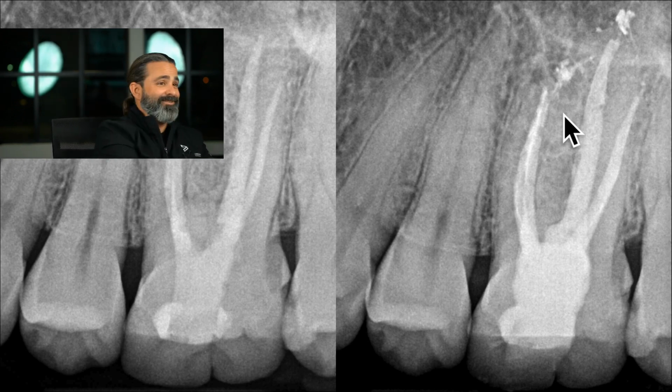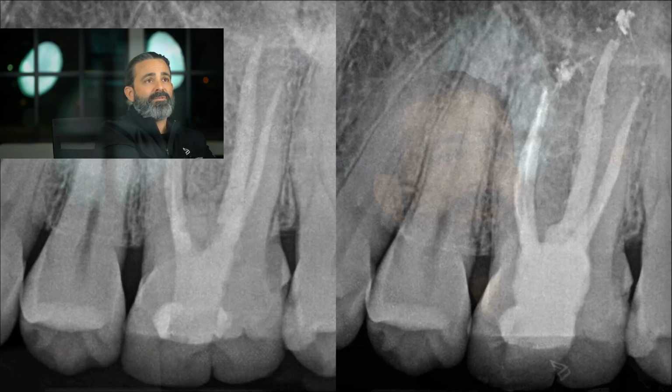And that is it. What do you guys think? Another retreatment case down. Hopefully you guys find this somewhat useful.